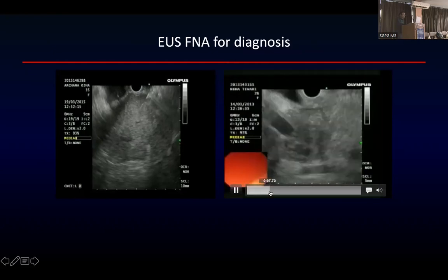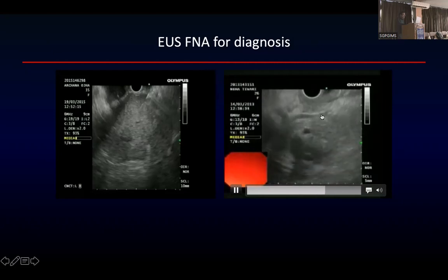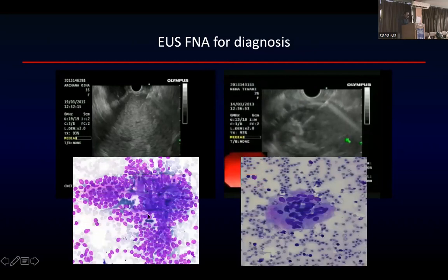Same another patient again. So this is near to the probe, imaging from D1, CBD, portal vein, large mass. Portal vein looks to be involved here. Again, a young female. This turned out to be tuberculosis. Again, 2013. So this is the pancreatic duct. This is imaging you are doing from the D1. So this is how you sample this from one part. Again, you are not able to see good fanning in both of these videos. Okay. So this is what we got. This was an NET and this was tuberculosis, granuloma.